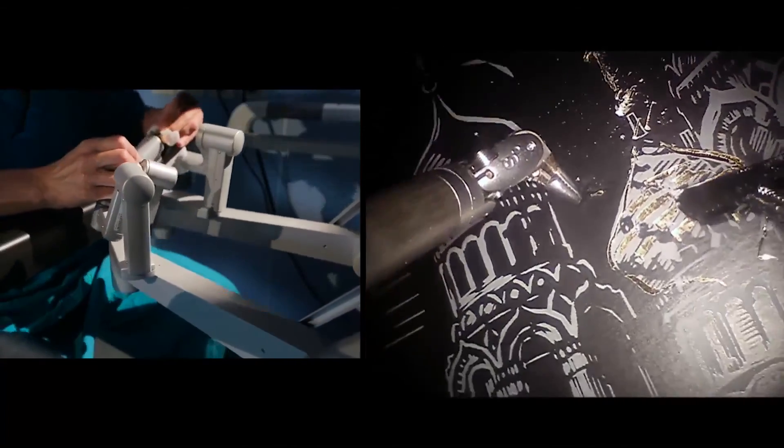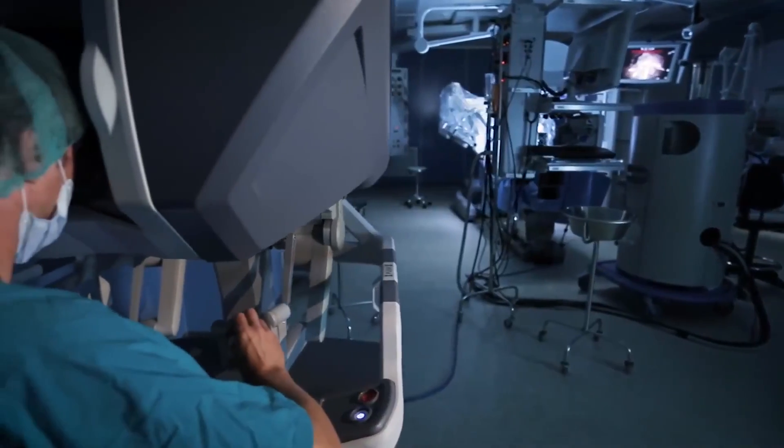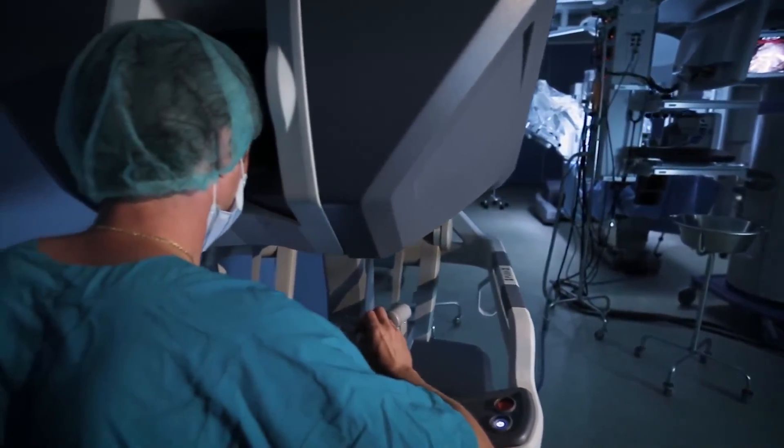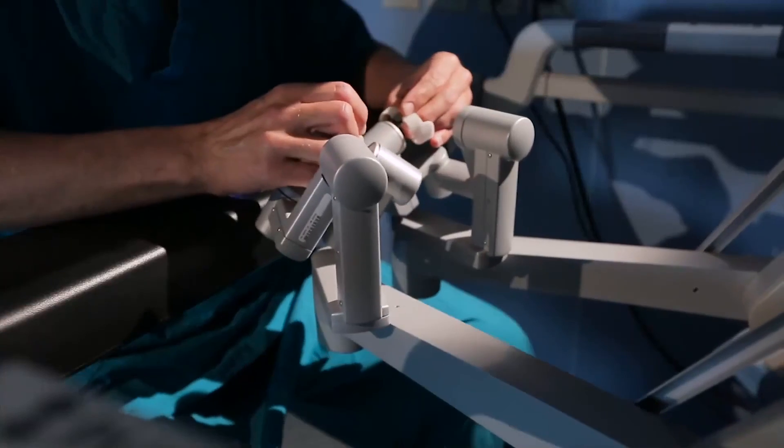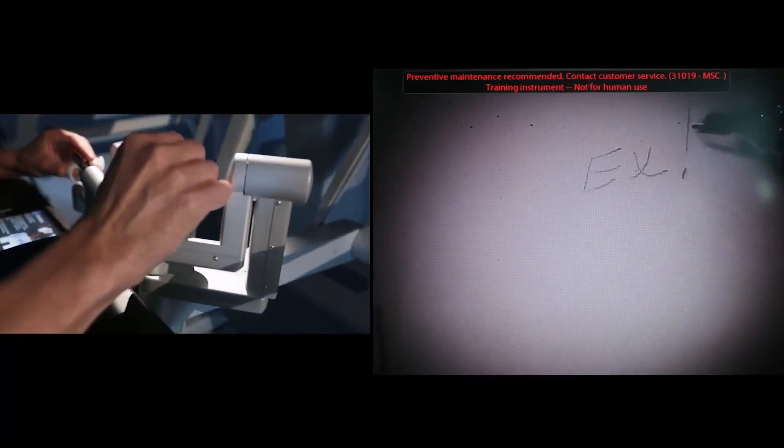But you shouldn't forget that it is all controlled by a surgeon. These are his hands and fingers which performed all the actions. The manipulators only reproduced those, decrease the trembling, perform more complex and precise movements, but it was still an imitation.